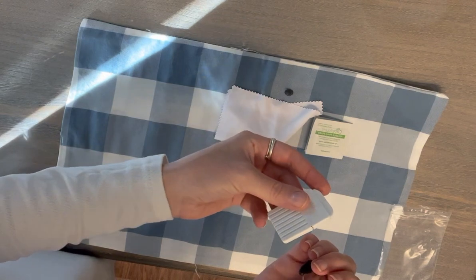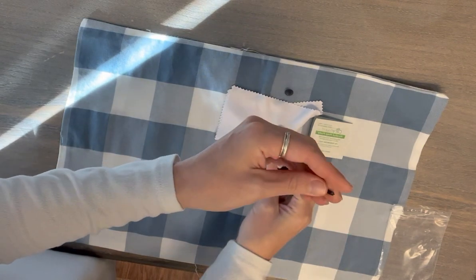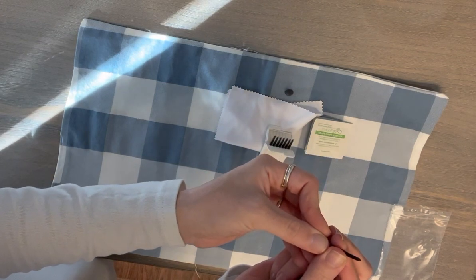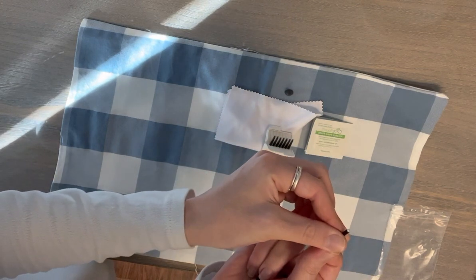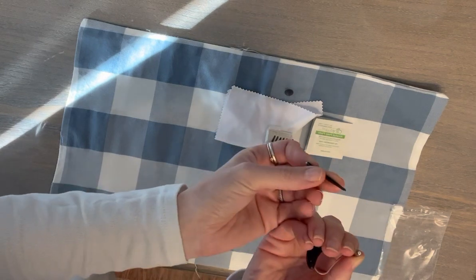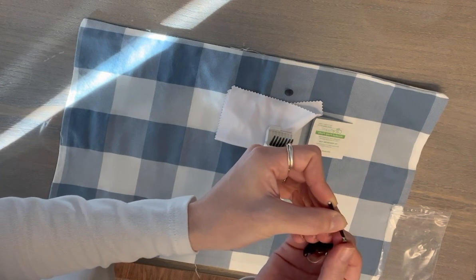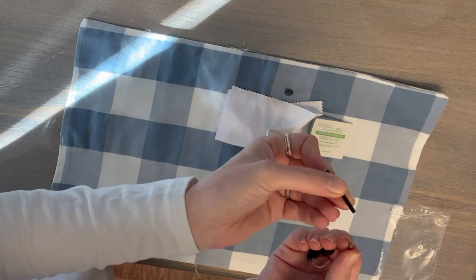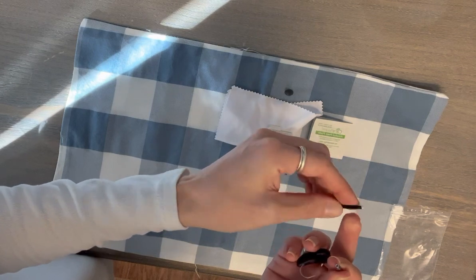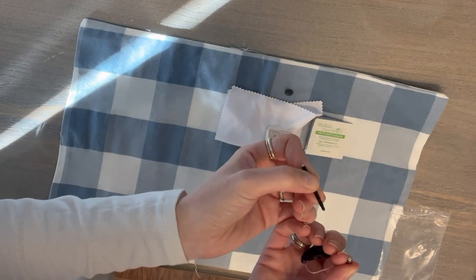So you have replacement filters. You take one out. You have an empty side, and then you have a new filter. So all you would do is put the empty side into the filter that's already in the device, pull up, this one will come out, flip the stick over, and here is the new one. You insert that right into the receiver.